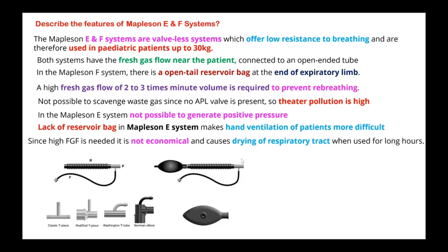In the olden days, all the breathing systems were made up of black rubber, which had an excess content of carbon to remove the so-called static electricity, because all the volatile anesthetic agents used in the olden days, like ether and chloroform, were all very inflammable agents. So any fire or any electric spark can cause a fire and explosion in the OT. So they were all made up of black rubber, which had a higher content of carbon, which prevented the spread of static electricity.